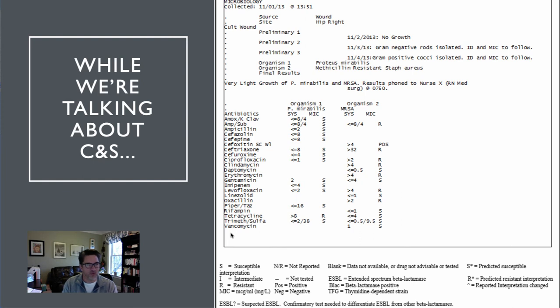Well, this is one of those little tricks that the ID guys never tell you because they always want you to consult them. No, I'm just kidding. They don't make methicillin anymore. They only make oxacillin. So when we identify an organism as methicillin resistant, we're actually identifying it based on its response to oxacillin.